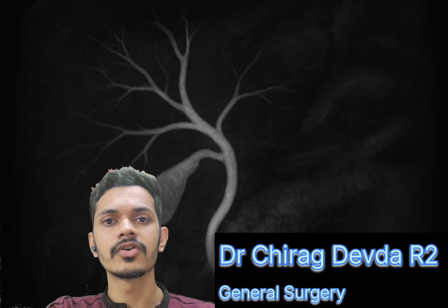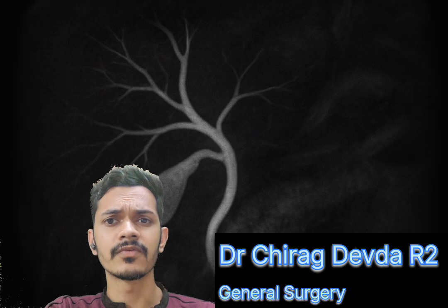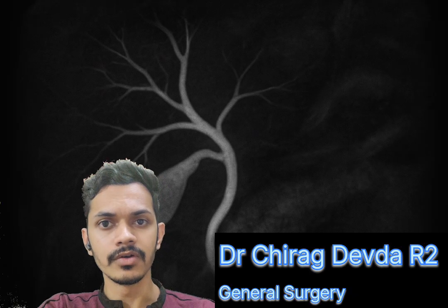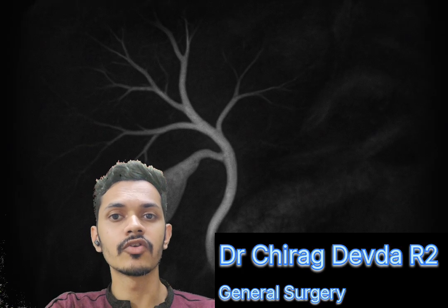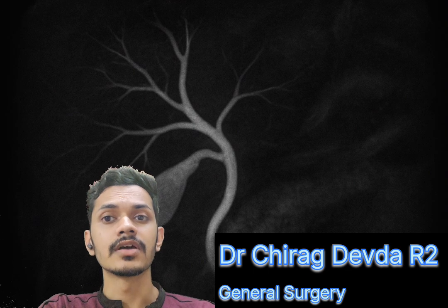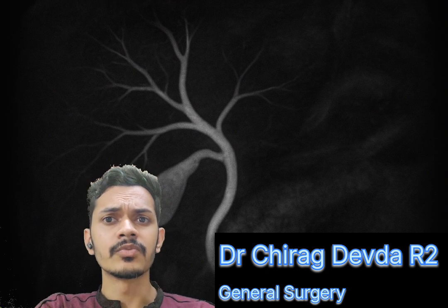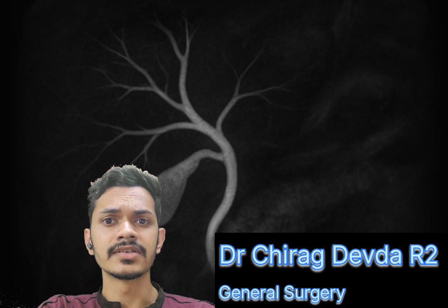If we talk about preparation, usually a 4 to 6 hour fast before the scan is needed to reduce bowel peristalsis or fluid in the stomach or duodenum. All metallic objects have to be removed. Antispasmodic drugs, for example glucagon or hyoscine, may be given to reduce motion artifacts from bowel peristalsis.